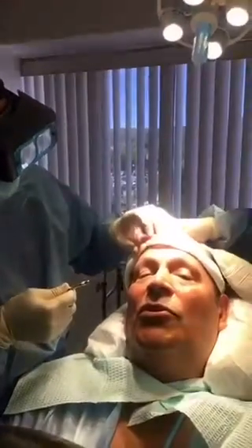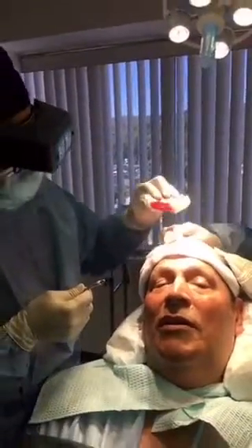The patient says the doctor is doing a tremendous job and he's enjoying sitting in the chair because he has a minimum of pain. On the sides, the frontal portion was nice and dense. We extended to the corners and added some grafts to the eyebrow. When doing eyebrows, it's very important to see the direction and distribution of the hair. The directions always go from the top portion down and to the side, and the brow goes toward the top and middle so they converge at the middle and make the eyebrow the way we see them.